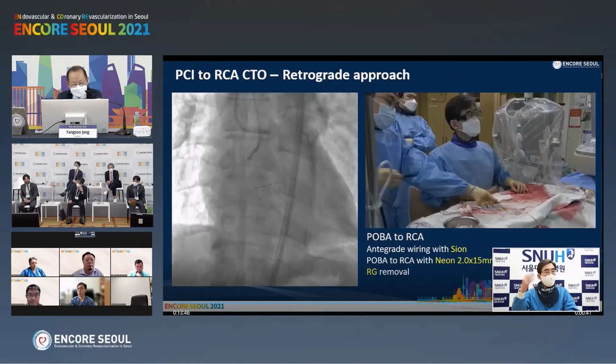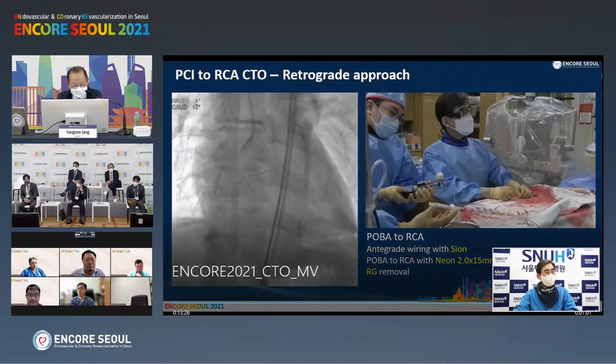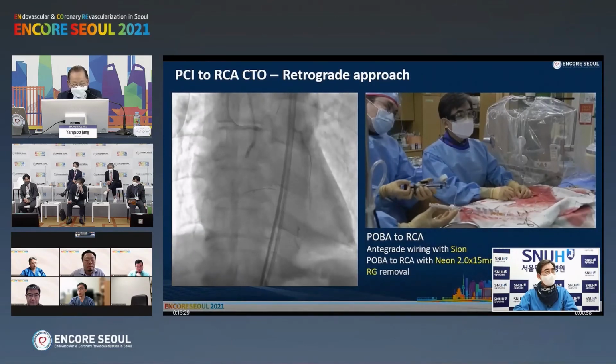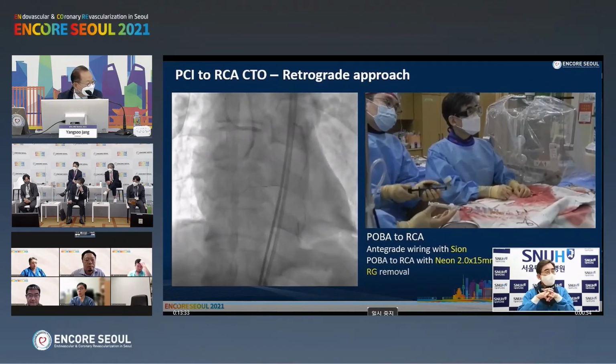It looks like a blunt end. It looks like, but you don't know. You are convincing too much, angio guy. Eh? That's it? Fight is over?